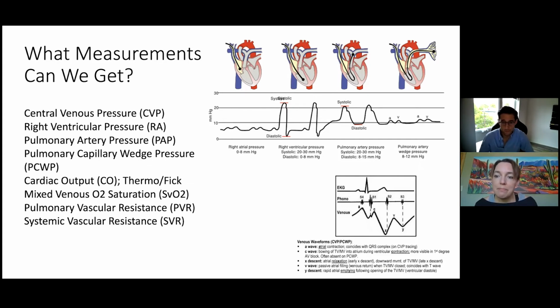Great. Yeah, that's pristine. But a few things also that I have to say for the people who will be on the CVI is when you have this tracing for the specific patient we are seeing now with new onset AFib, you will not see an A wave, right? Mm-hmm.